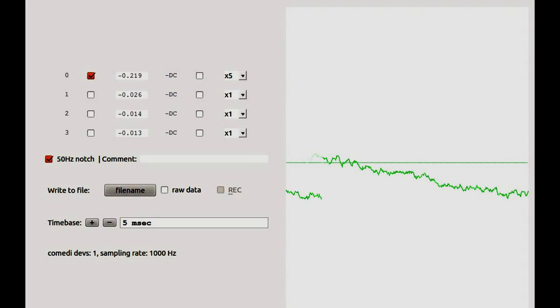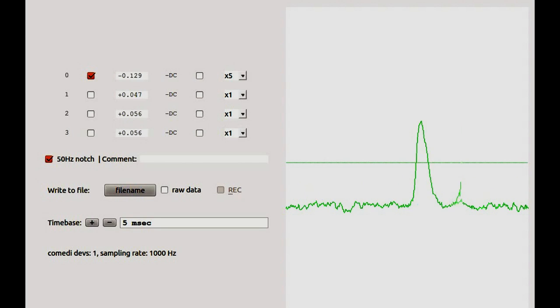Hopefully. We'll have you relax completely. Try not to move any facial muscles and try not to look around the room. Try to fix on a point and just completely relax, and hopefully we'll remove all the EMG on the signal and we'll see something closer to what we'd expect your EEG to look like.